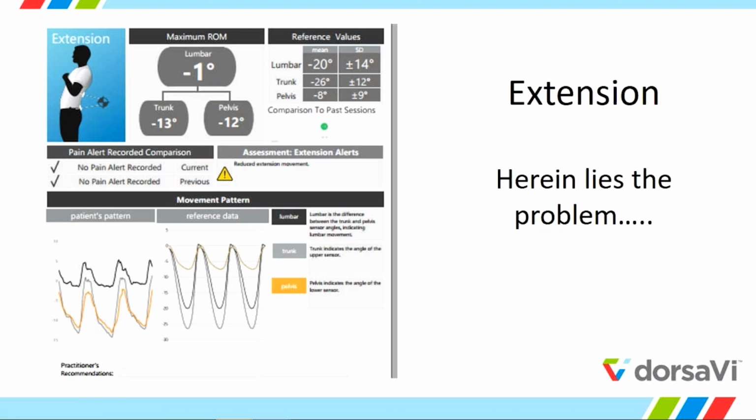From all the cases we've seen, this is by far where there was no mobility. I'll tag on and give you another example. I know we're getting to the end of the hour, but along those lines of looking at where he was in sit, his pelvic range was less than in stand, and that's another thing you can use the test for.